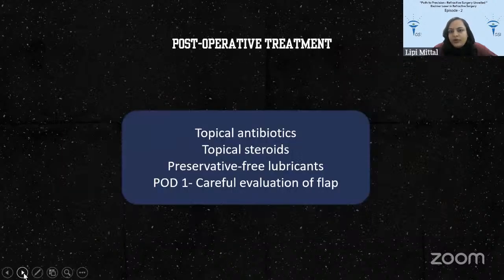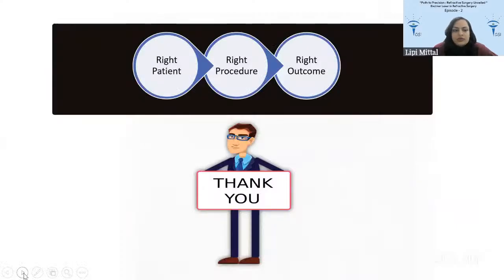So the post-op treatment includes topical antibiotics, a short course of topical steroids, preservative-free lubricants, and a careful evaluation of the flap on post-operative day 1. The patient can be asked to resume normal activity from the next day. So we should choose the right patient and the right procedure in order to have the right outcome. Thank you.